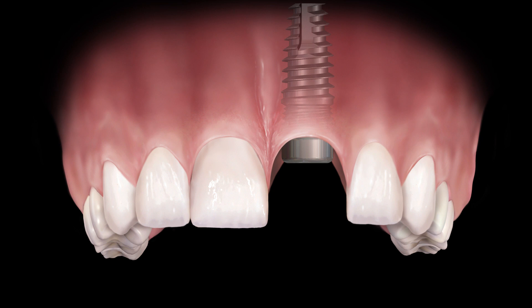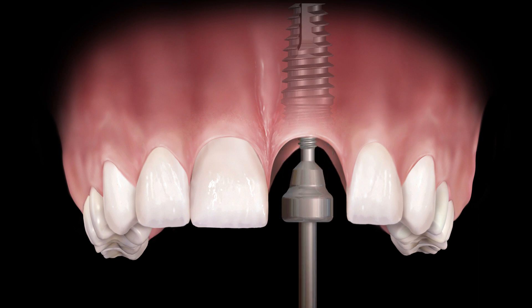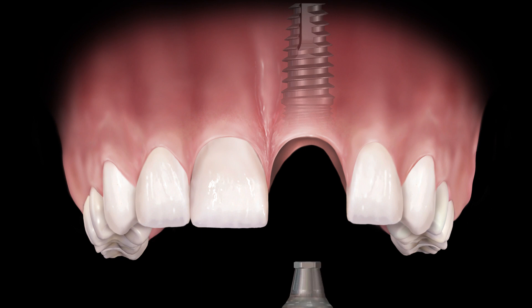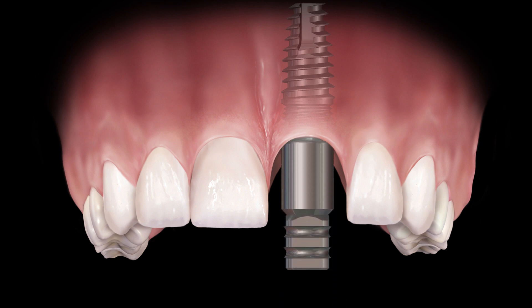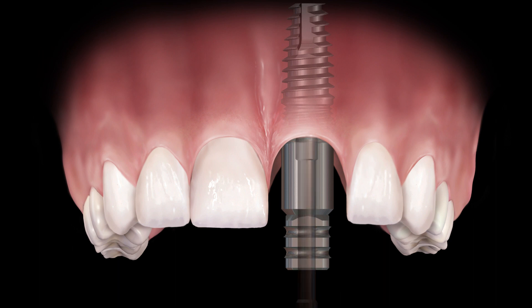After the implant is adequately integrated, remove the healing abutment and insert the multi-purpose abutment. It is important that the mating area of the multi-purpose abutment fully engages the mating area of the implant. Tighten the fixation screw only with finger pressure.